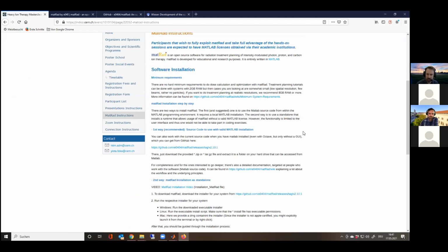We cannot guarantee that we can solve all these problems. I know I have to make all these disclaimers, but it's a research software. It's tested on a few systems. There is some automatic testing, but not to the extent that a company that focuses on software development would do. So we might end up with a situation where it doesn't work for everyone. On the one hand, I really want to apologize if anybody has issues that we cannot solve, and you end up only watching along with what we are doing and learning by that.